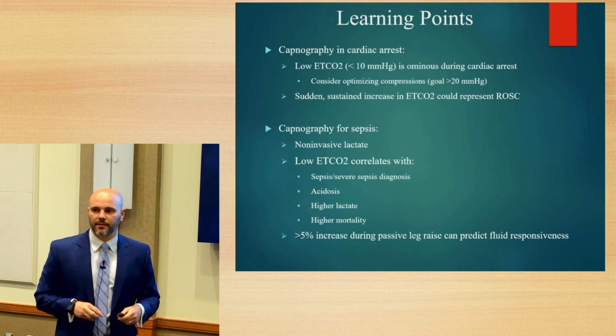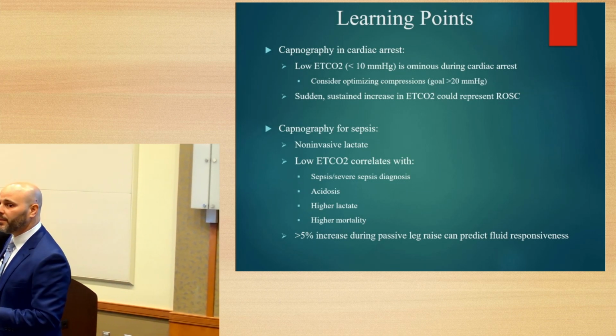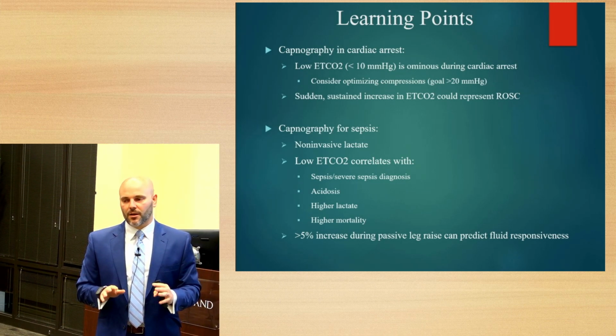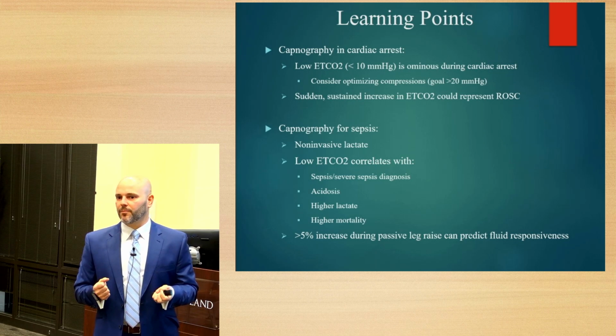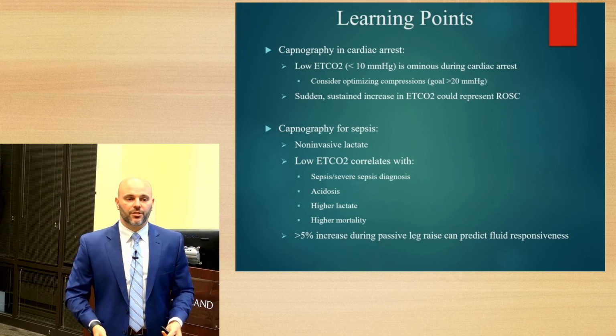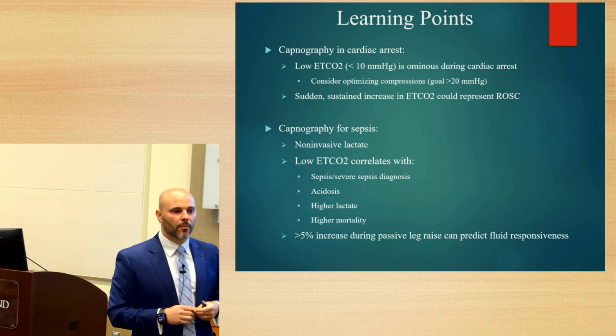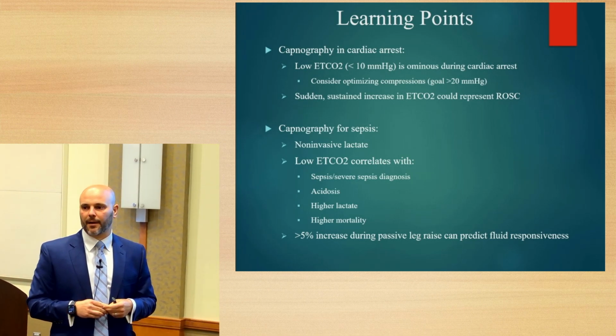For cardiac arrest, if it's low in the beginning, try to improve your compressions. If it stays low, you're in trouble. It portends a poor prognosis. If you see a sudden rise in end tidal CO2, maybe it's a good idea to do a pulse check to see if you regain ROSC.